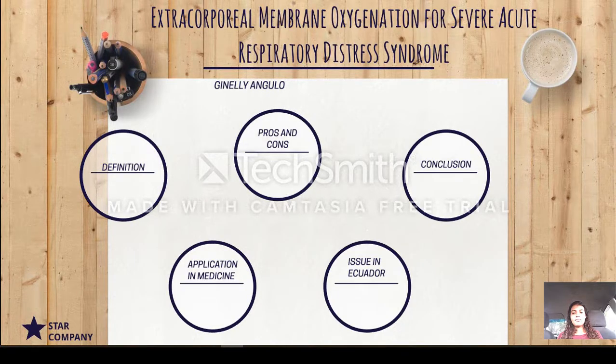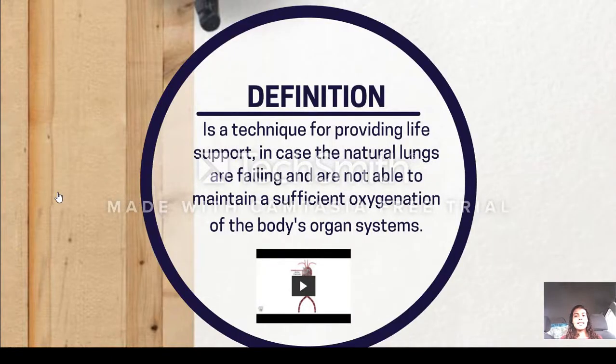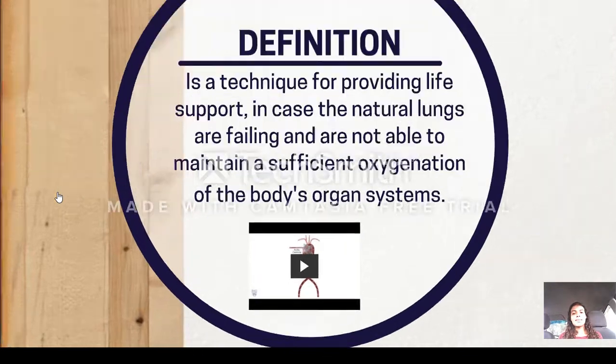Extracorporeal membrane oxygenation for severe acute respiratory distress syndrome. Definition. ECMO is a technique for providing life support in case the natural lungs are failing and are not able to maintain a sufficient oxygenation of the body organ system.